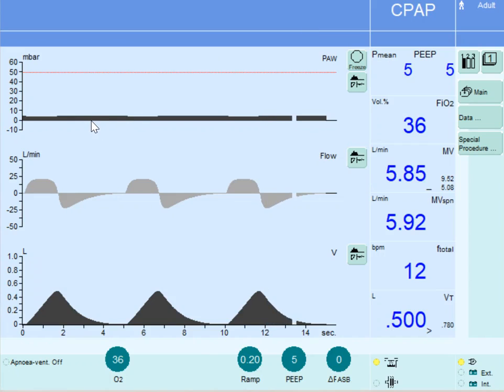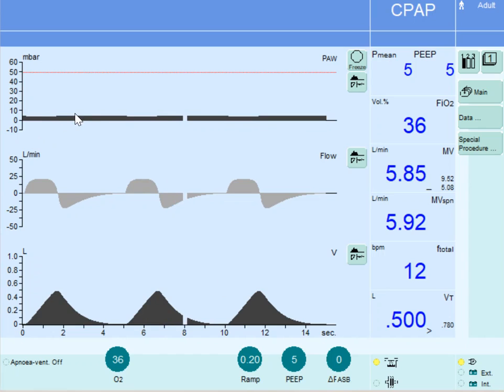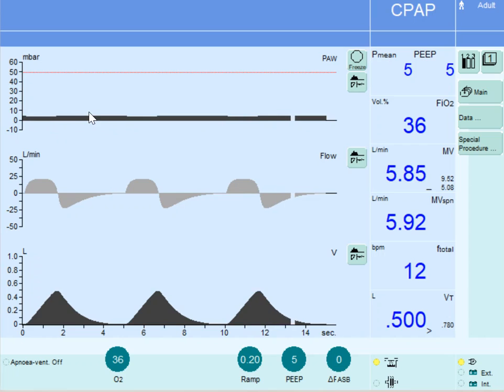In continuous positive airway pressure, which is CPAP, the ventilator maintains a positive pressure value determined by the operator. In this example, it is 5 cm of water during both inspiration and expiration.